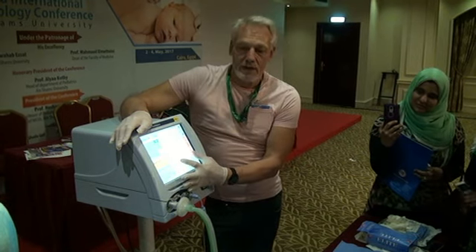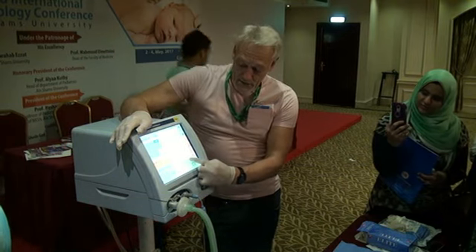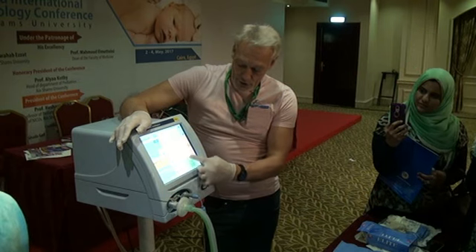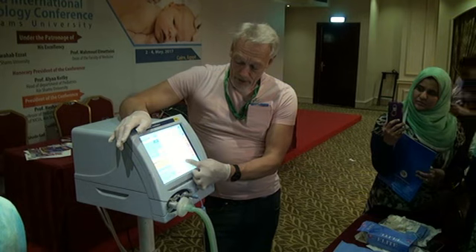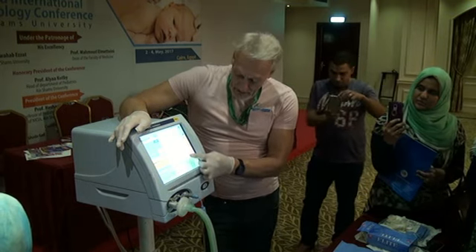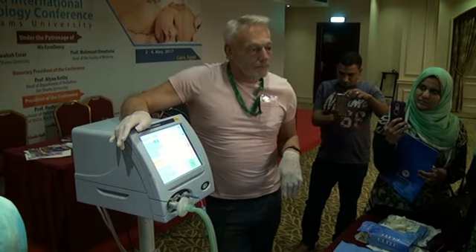This curve is nowhere near as fat as it was. The length of time it needed to inflate the lung was quite long, and now it's shortened over time because I'm giving the baby PEEP. So to open the lung is just taking us to about 20 before the lung opens.